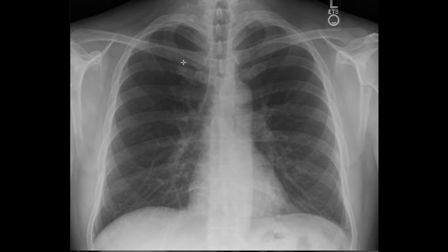Then you have the clavicle, the collarbone, right here. It goes in a transverse way to articulate right here with the area of the scapula, the acromion, to form the acromioclavicular joint, the space right here. It's not shown here. And then this is the scapula.